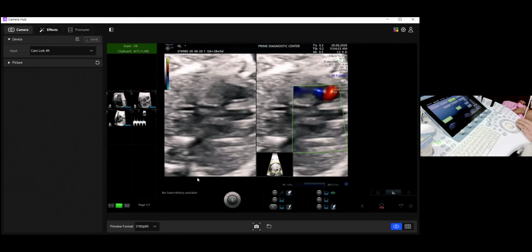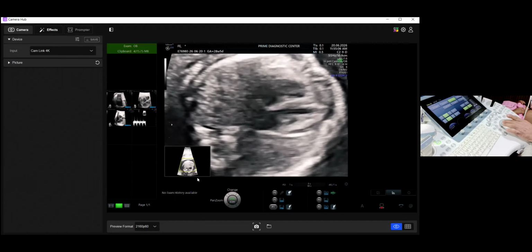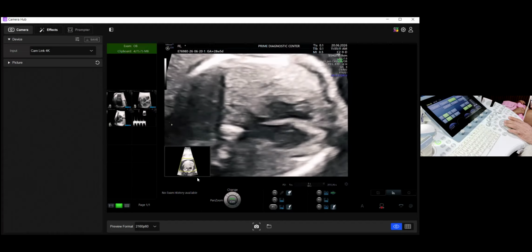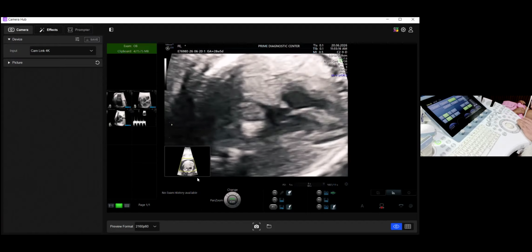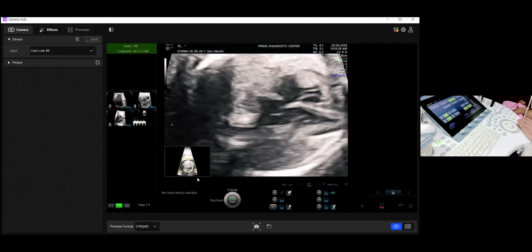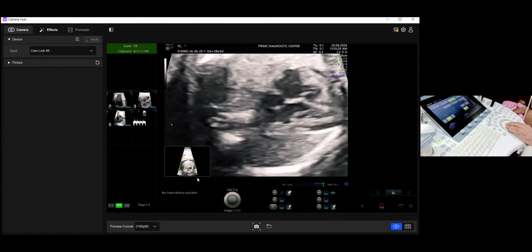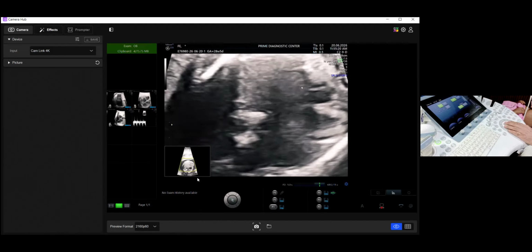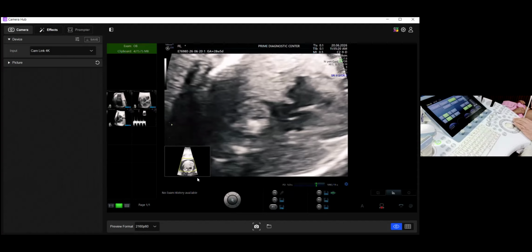Okay. So let's say if I put the color Doppler off and I just see 2D, the frame rate is 55. The frame rate has improved. So putting on the color and looking at side by side, the frame rate is lower than in case you are just interested in 2D. So again, the right atrial appendage. Okay, the right atrial appendage, I'll run the cine for you. All right. So then go back to the live scan.